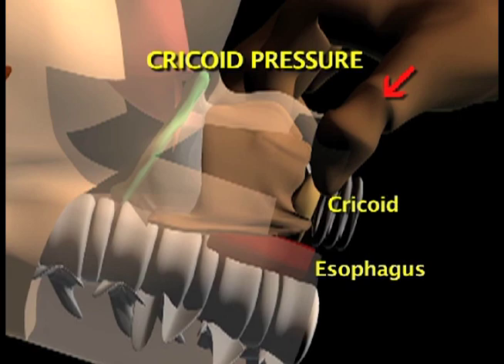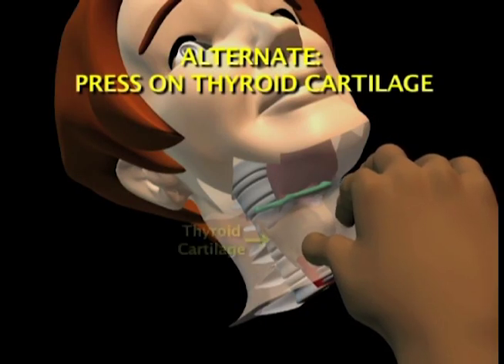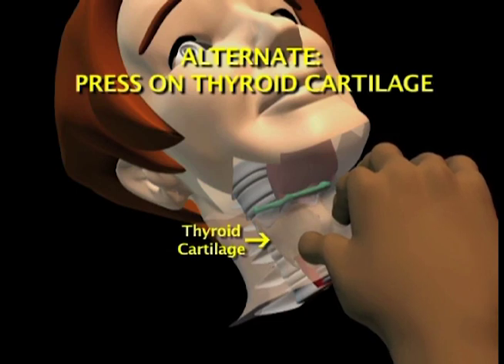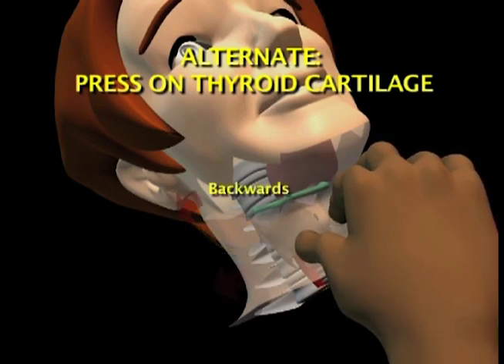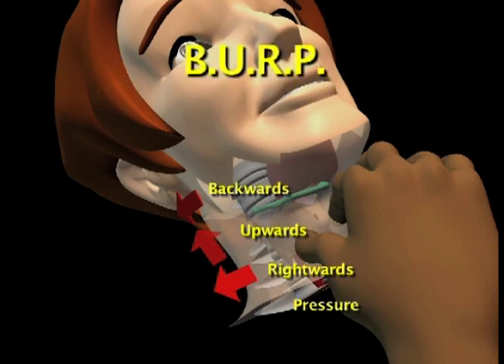If pressing down on the cricoid fails to improve the view, have your helper apply pressure on the thyroid cartilage aiming backwards down against the vertebral column, rightward towards the patient's right side, and upwards toward you. This maneuver is called BURP — B-U-R-P.